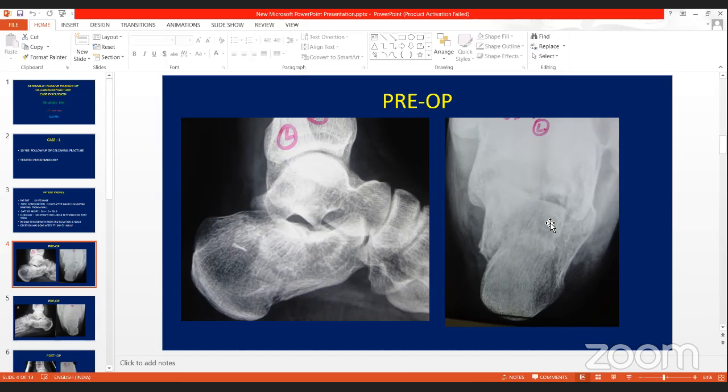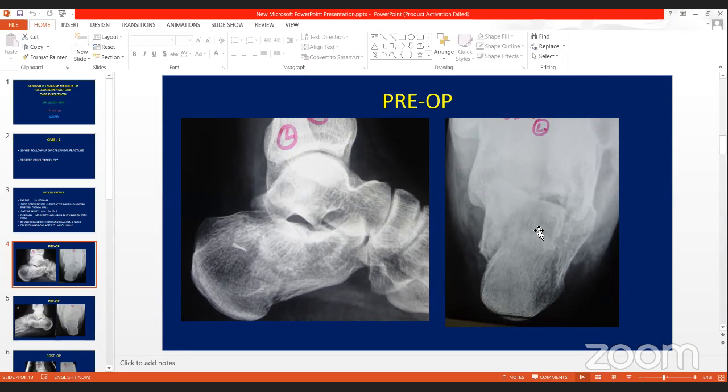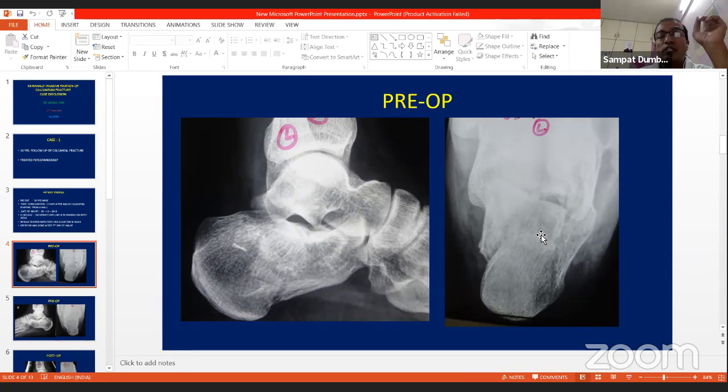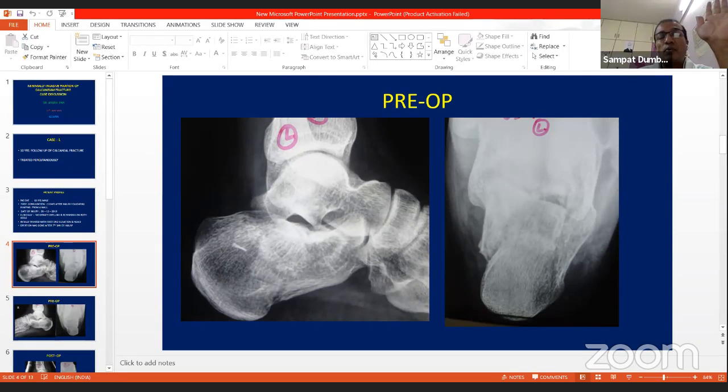But the part is rotated here and depressed. This fracture is depressed here in the lateral view, which we see. When we elevate it, the rotation changes here, also in the axial section. Then you have to see if you need the sustentaculum screw, because that is the most vital screw as far as the interarticular anatomy is concerned. So I agree with you. If I have to put a screw, that will be the important screw.